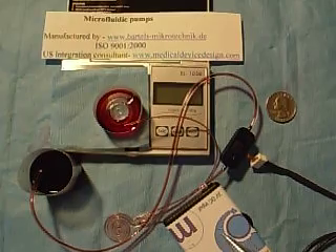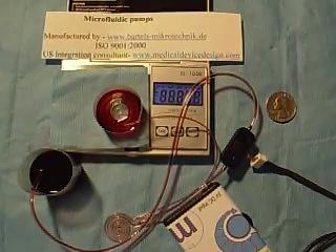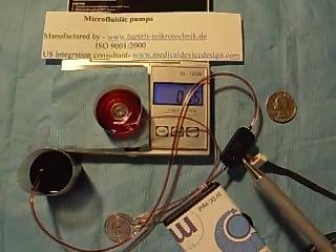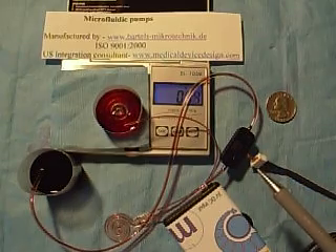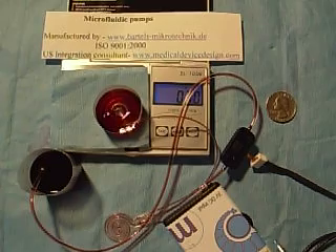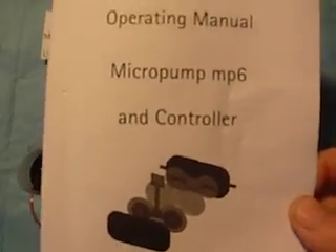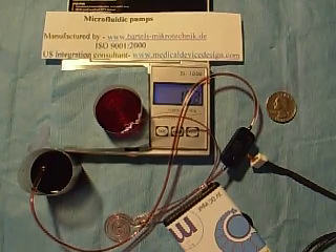The flow rate is measuring approximately 4 mLs a minute, and it can be adjusted accordingly with the potentiometer. The internal pump surfaces are a chemically inert polyphenylene sulfone. The pump should have no problem taking ETO or gamma sterilization. This pump is thoroughly documented in Bartels' operating manual, and they have done an excellent job describing the operating and performance specifications. This can handle both liquids and gas.